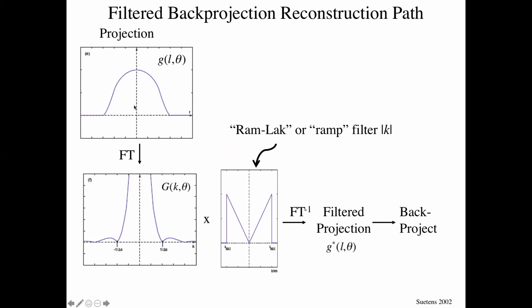When we take its Fourier transform, we know this is a projection or a sample through the 2D Fourier transform of our object. So here it is. We multiply it by k, the magnitude of k. So that's just a simple multiplication. For those of you who like to think of this as filters, this is basically a filter, and it's a filter that crushes everything in DC.